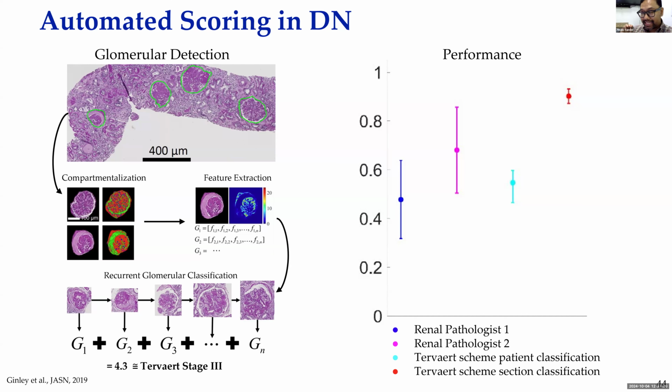Or that we designed. The second case study is transplant outcome prediction. We took about 29 transplant surveillance biopsy cases, and of course I have a better result than this. I think one of my students is working on that. She's using hundreds, thousands of transplant biopsies, but in this case we have transplant surveillance biopsies. These are from one year post-transplant, and from each biopsy we segmented the glomeruli, this functional tissue unit, and from these glomeruli we extracted the features that we talked about.